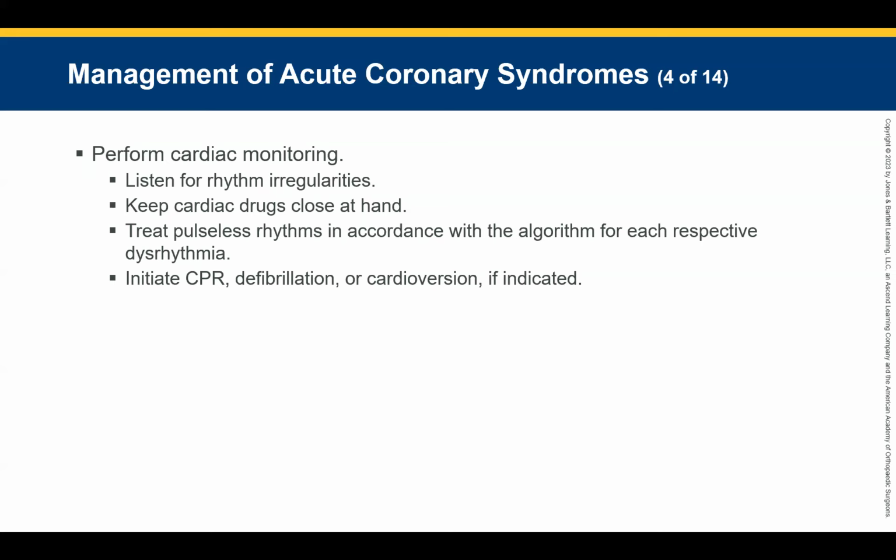So Mr. Smith, based on your symptoms, the indigestion, and what we're seeing on this cardiac monitor, it looks like you are having a heart attack. Now, you're in great hands. We're gonna take good care of you. I think our best option, if you're okay with it, since we are 3 hours from a cardiac center, we're gonna go ahead and get the helicopter here. They'll be here in 20 minutes.